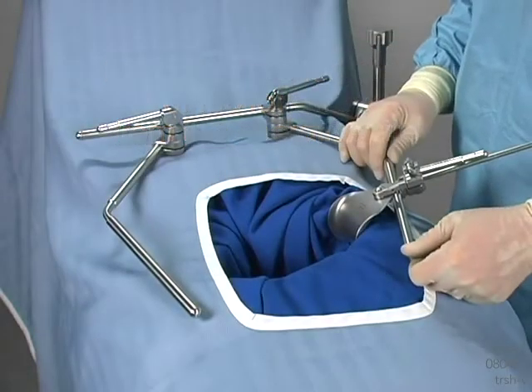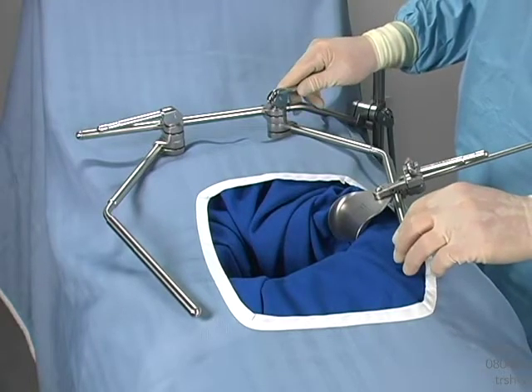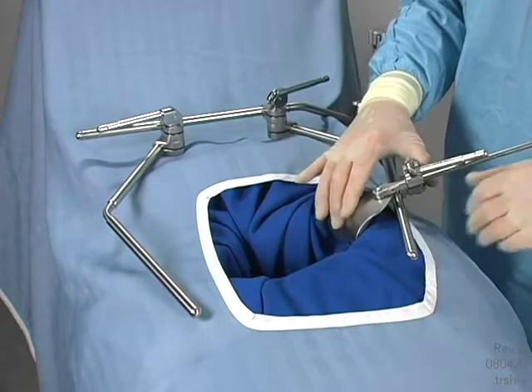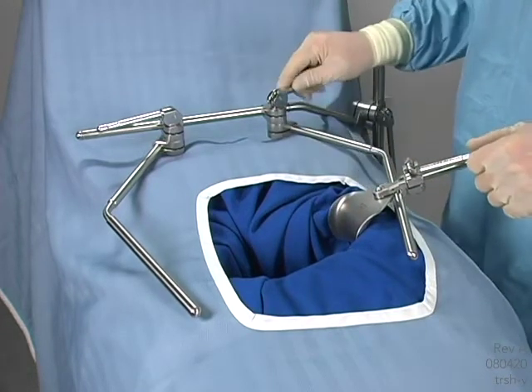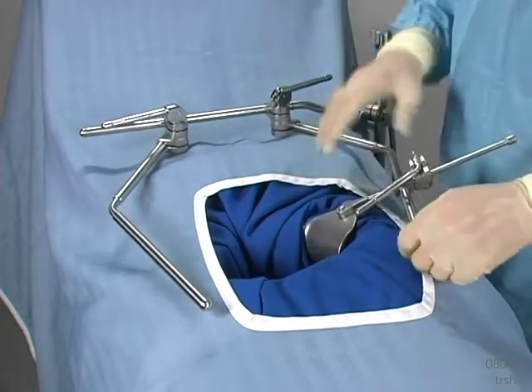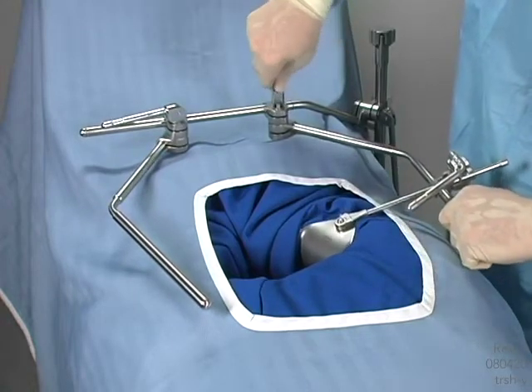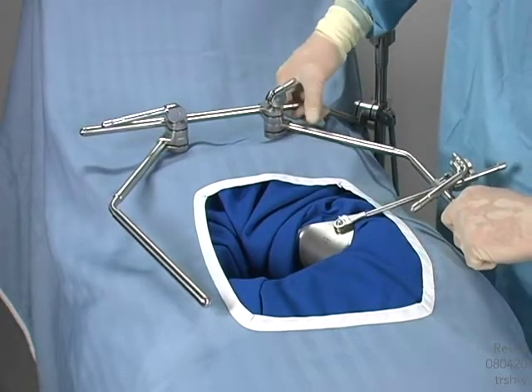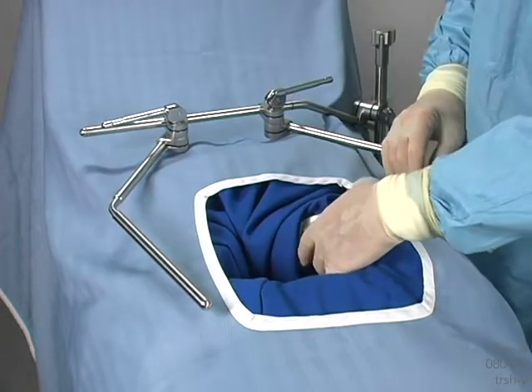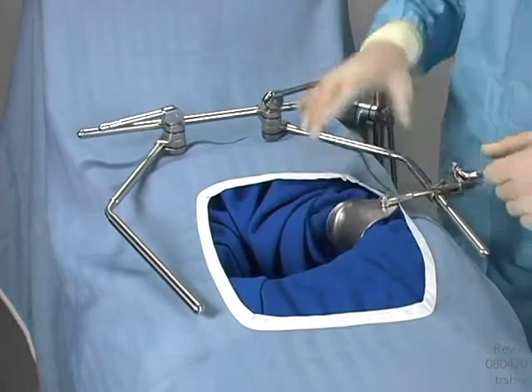Retractors are too close or too far away from the operative site. An exclusive feature of the Thompson Retractor is the independent adjustment of the extension arms. A general guideline for placement of the extension arms is 6 to 8 inches away from the incision. Improper placement may cause retractors to be either too close or too far from the operative site. To adjust the placement of an extension arm, relax the tension or remove retractors, grasp the extension arm with one hand, and simultaneously release the cam joint holding the arm in place with the other hand. Reposition the arm as needed and lock in place.